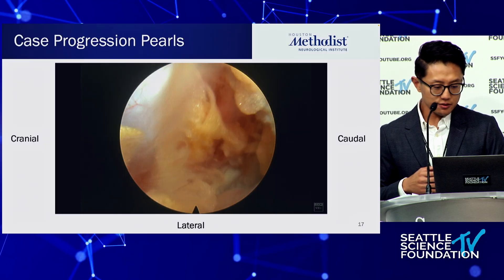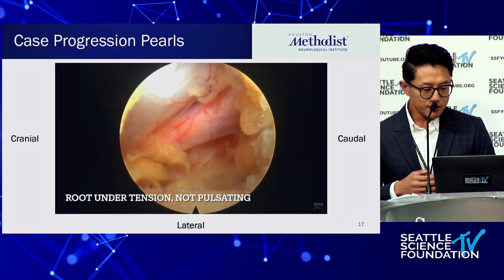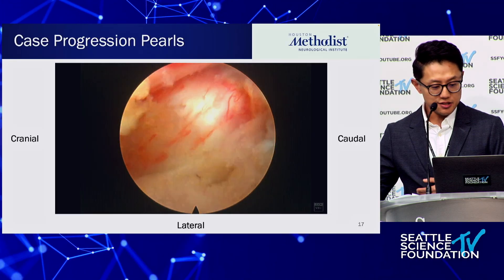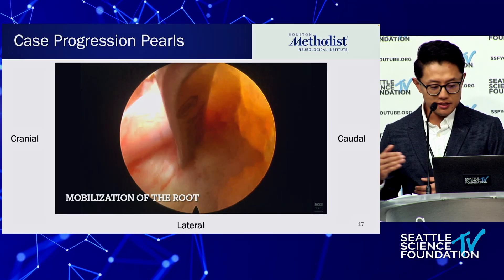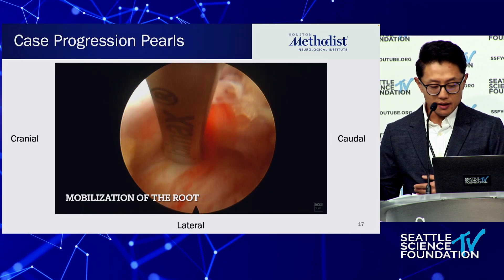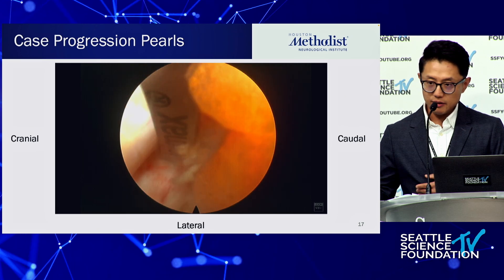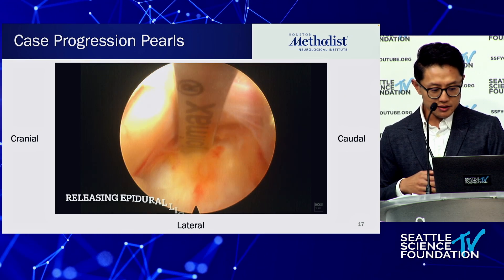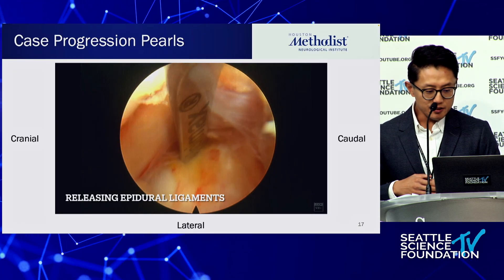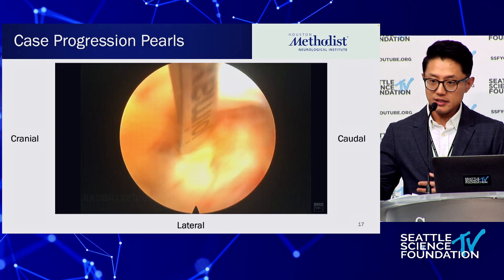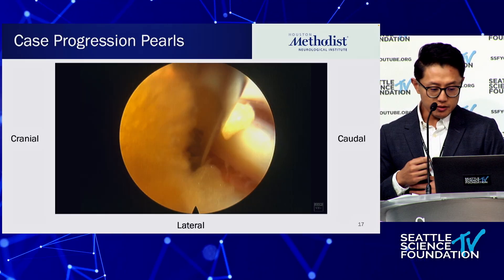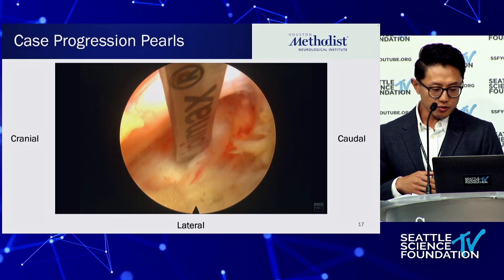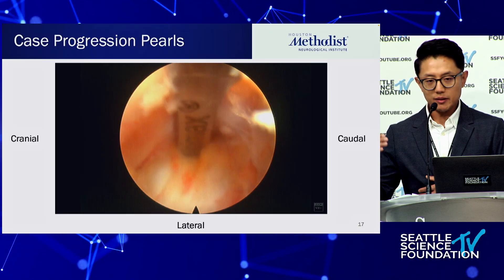You'll often have to deal with epidural fat, which covers the traversing nerve roots. Carefully remove it. Once you identify the root, you can see it's bowed up and under tension from the disc herniation underneath. It's not very mobile. We like to mobilize this root so we can put our cannula in and rotate it out of the way. You'll see epidural ligaments right on the side of that root — if you don't release these, it's very hard to mobilize.